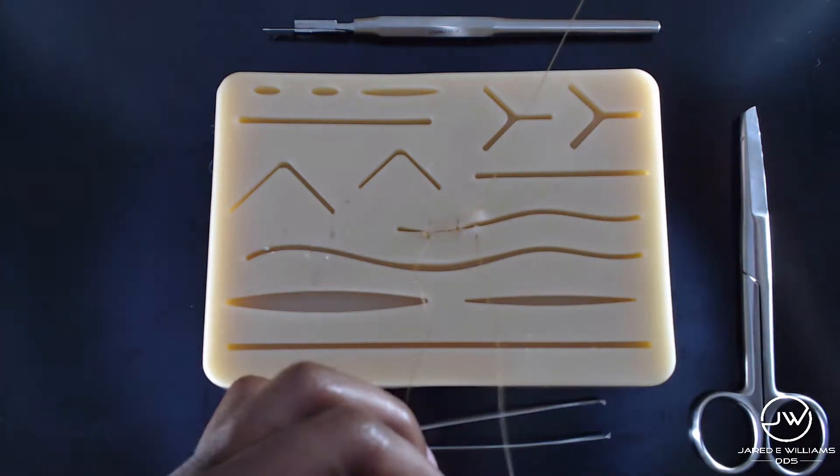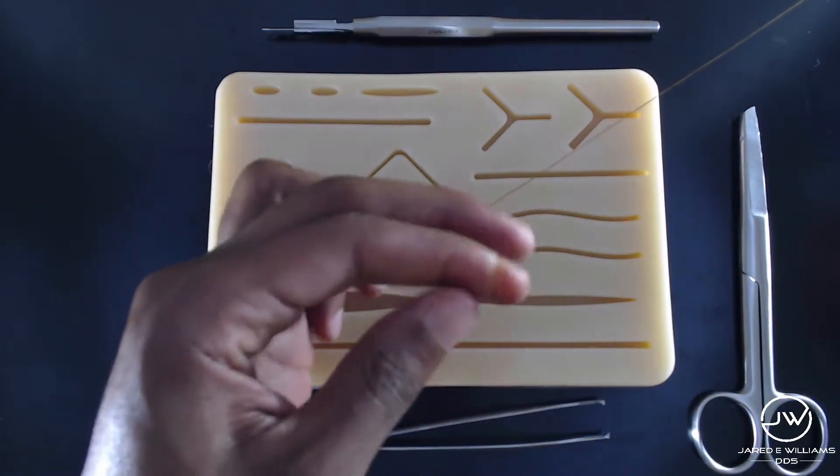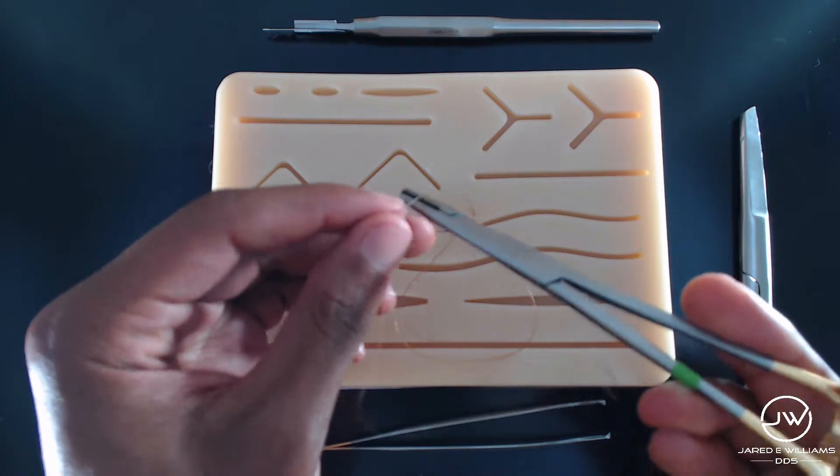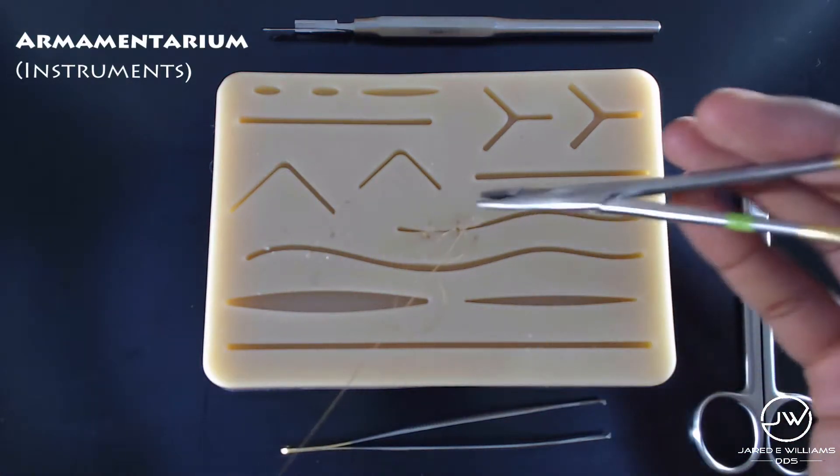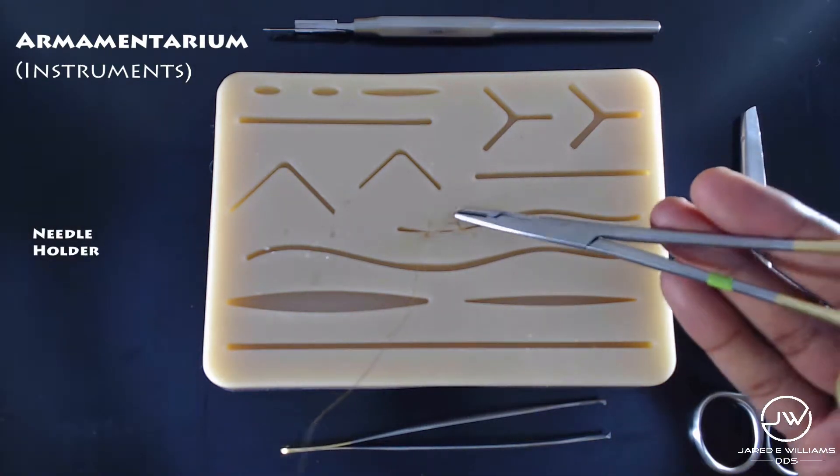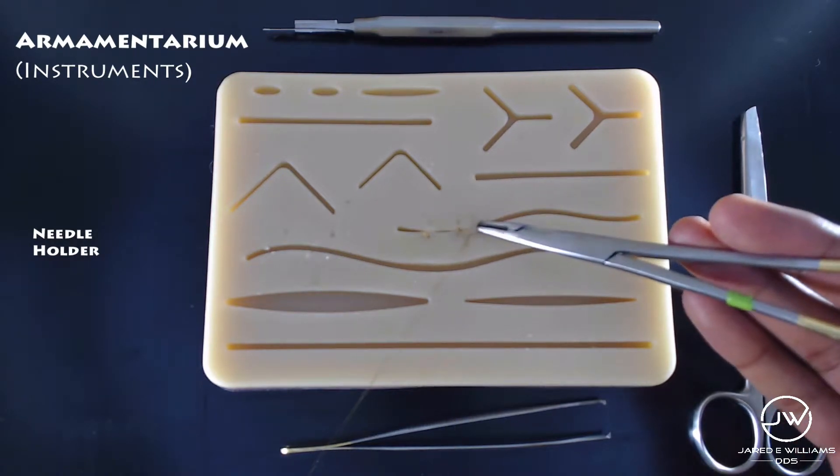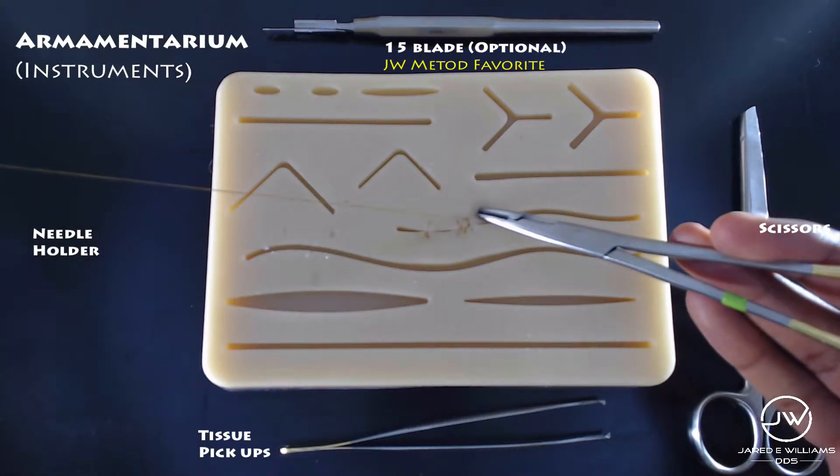Let it pass all the way through. Now, with my tail here, I'm just going to turn it around and slide the back end of my suture underneath it and then pull. Make sure, because sometimes these sutures will get knotted on you. So, you just want to make sure that when you're pulling, it has a nice flow to it.